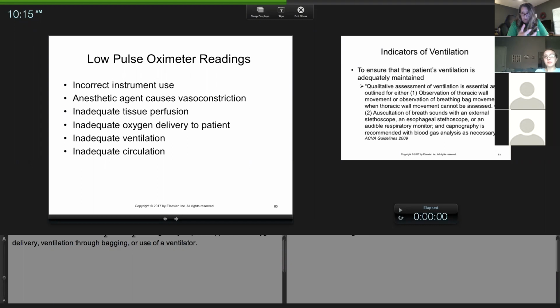He maybe had some scar tissue or had maybe a previous pneumonia. When he healed, it formed some scar tissue. So his lungs weren't very stretchy. They weren't compliant. So it required me to push more oxygen to the patient. So one thing I do is, if I've checked all that, when you bag your patient, when you squeeze more oxygen, does it go up? If that makes sense. Because maybe what's happening is the lungs aren't inflating enough. So I check probe, I check oxygen source, and then I check my patient.